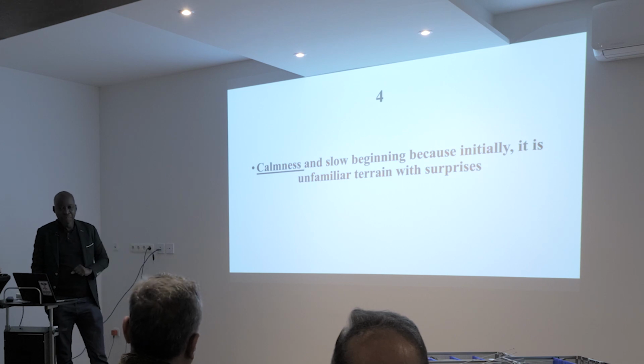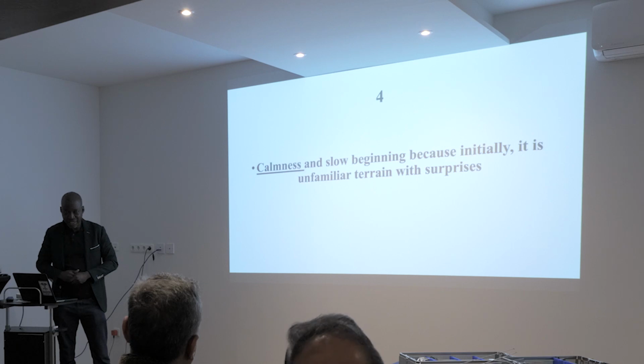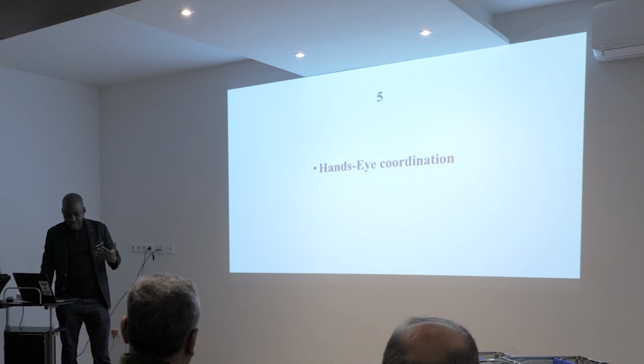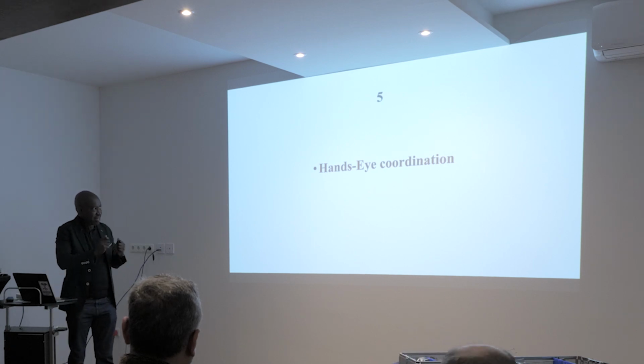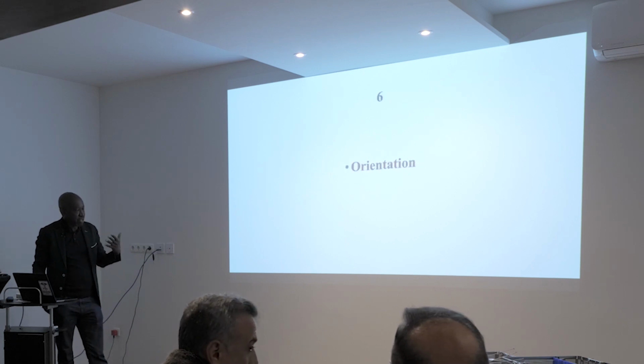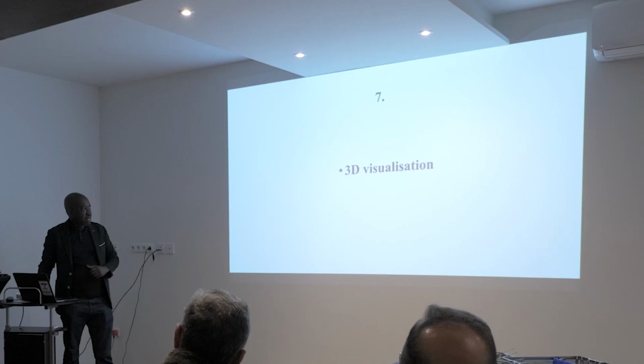And you have to be calm, especially when you are beginning, because you are in unfamiliar terrain and might have a lot of surprises. There must be hand-eye coordination: as your hands are moving, your eyes and hands should work together, and you have to be well oriented in how you are going in.